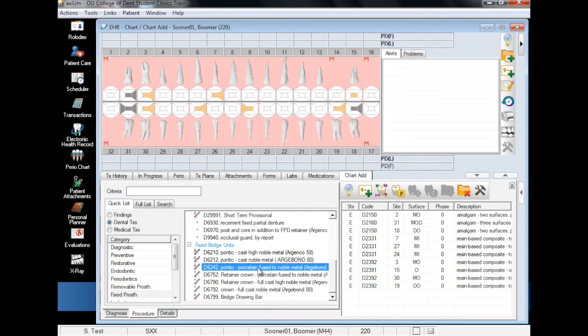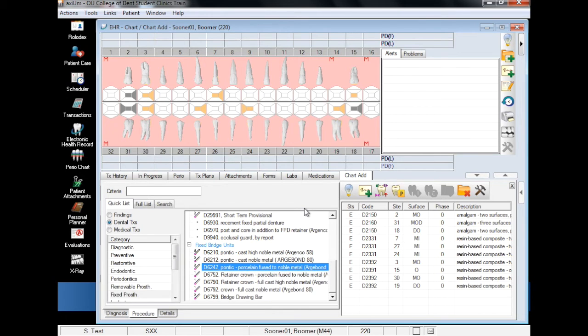First, we will add the pontic. When adding a pontic, note the material type as the pontic and retainer are usually the same material. For this demonstration, we will select Porcelain Fused Noble Metal.